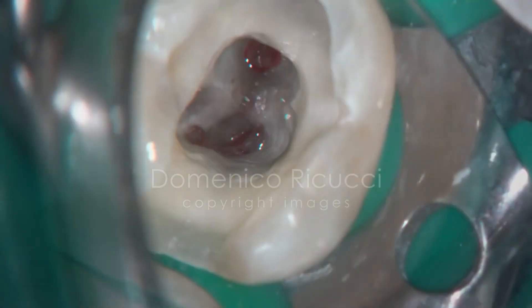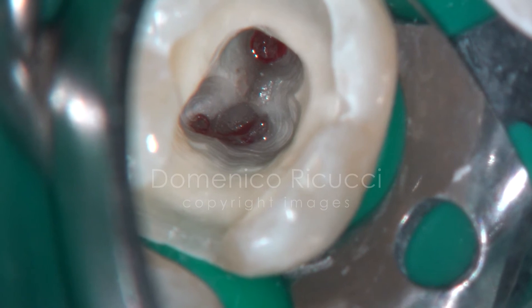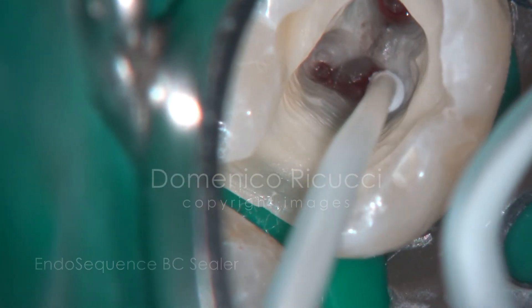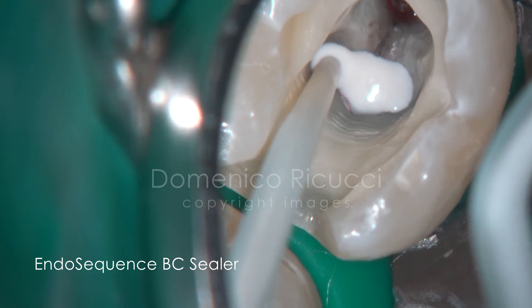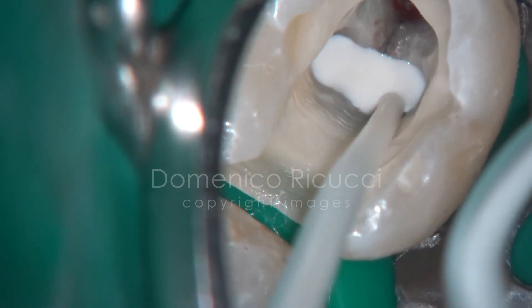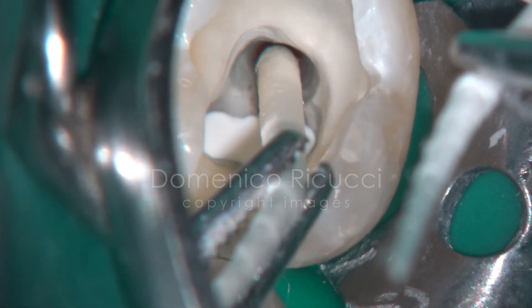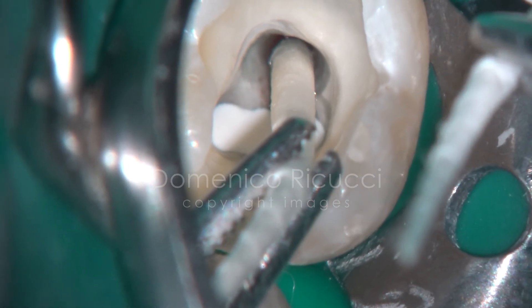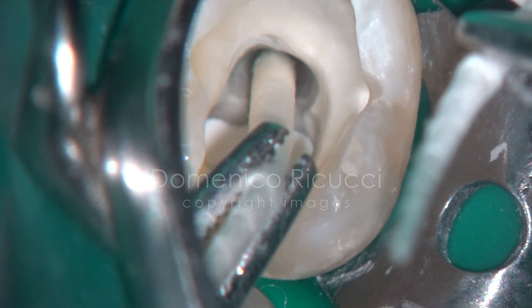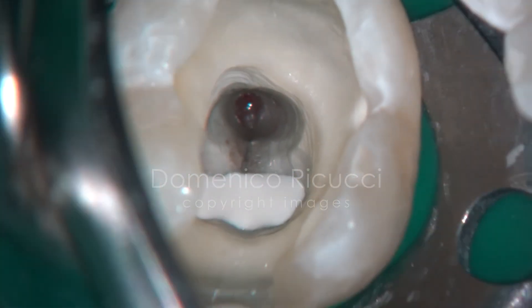After hemostasis, pulp wounds appear vital. Wounds are covered with a bioceramic material. Excess moisture at the distal orifice is gently absorbed with the blunt end of a large sterile paper point before capping.